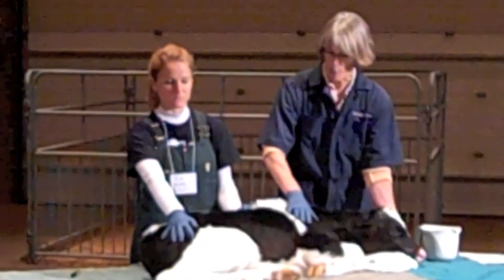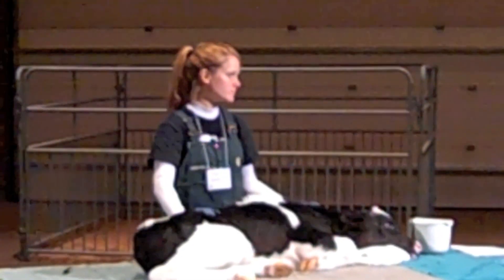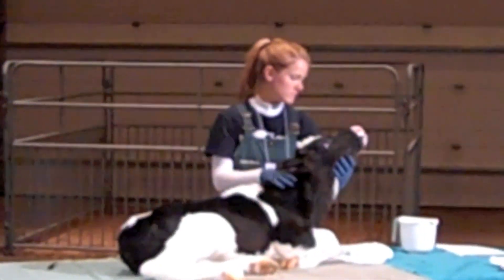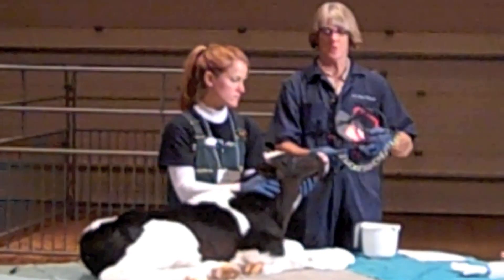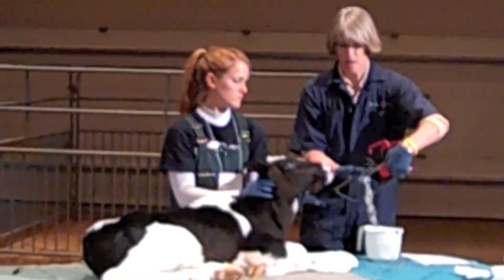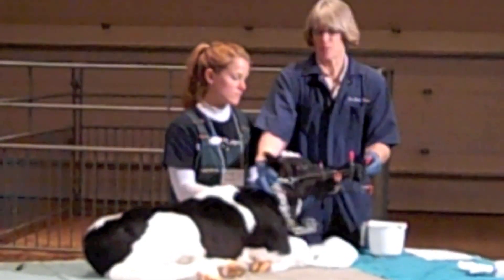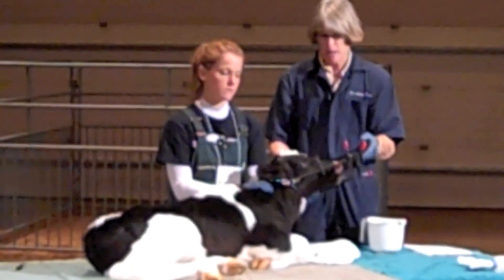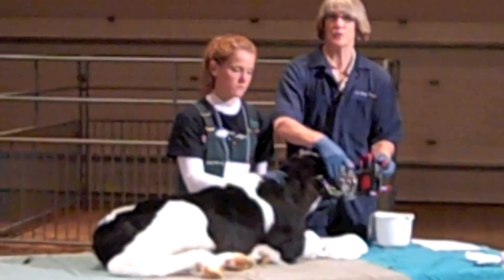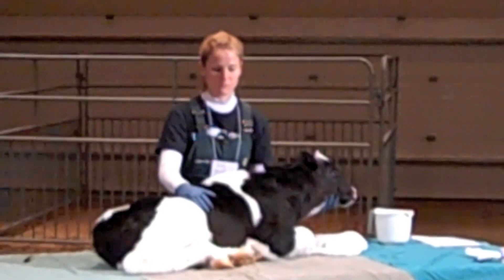If he wasn't sedated, there are many helpful tools to restrain the calf. You have handy tools that can be clipped onto the back of the pen, and when clipped on, you can restrain the calf behind the head and do your nerve blocks without the calf moving. There are helpful devices that would eliminate the need for sedation.